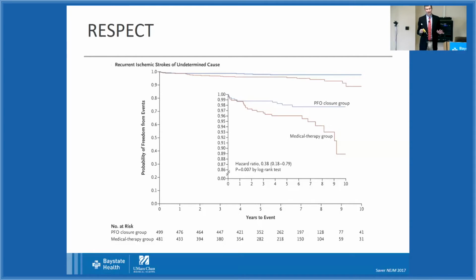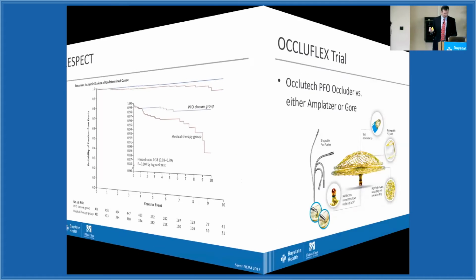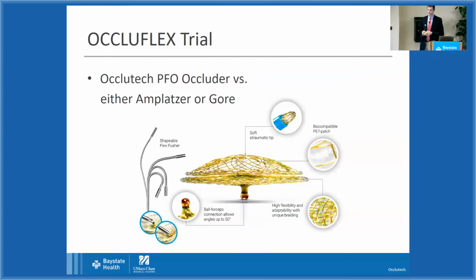So I'm going to show you, again, disclaimer, this is not an FDA-approved device, but part of a big international research trial. And I'm proud to say that Baystate actually is the number one participant right now in this trial. This device is part of the Occluflex trial. So this device is being compared to either of the other two devices, which I should be passing around. Let me pass those around. Here's a silicone septum with the Gore device and an Amplatzer device.